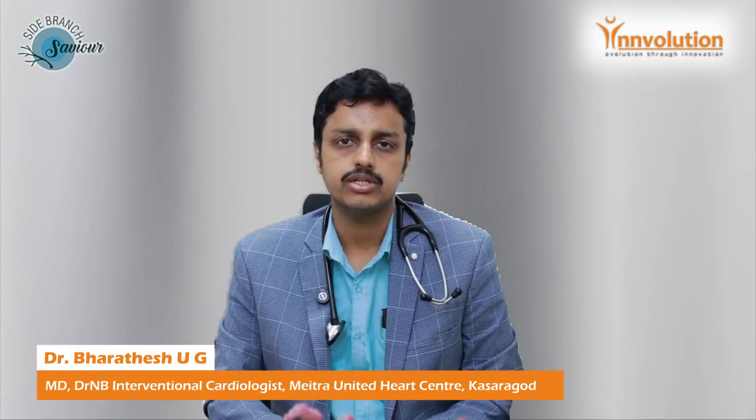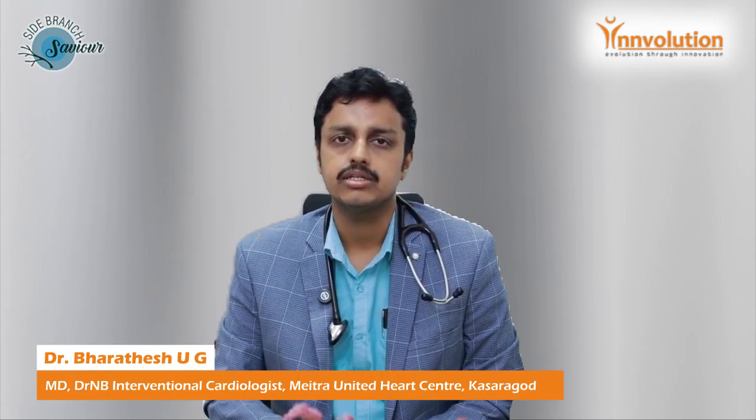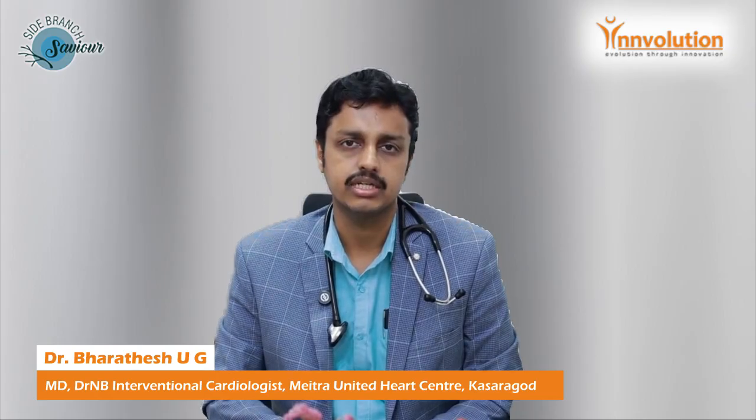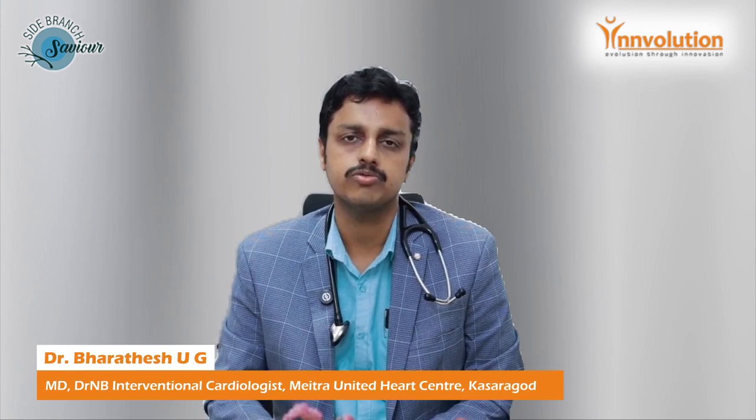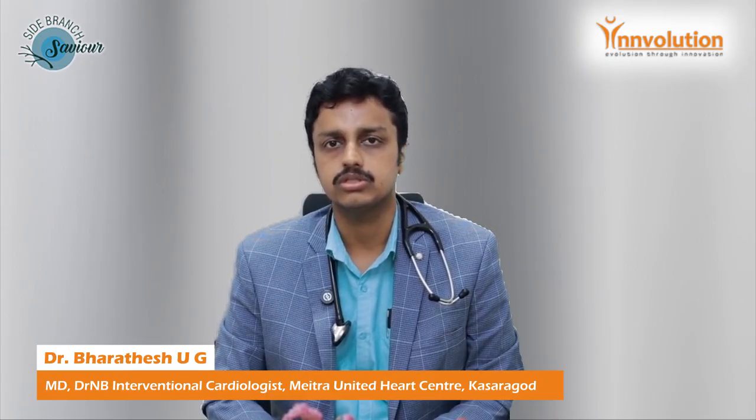We may require a larger population to study the rate of stent restenosis or thrombosis in side branch cases, maybe like 5,000 to 10,000 cases in a hospital study, and we may have to do a repeat angiogram after 1 or 2 years to look for the restenosis chances or recoil chances. So that is more important to know the restenosis chances.